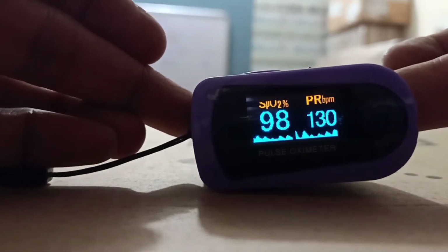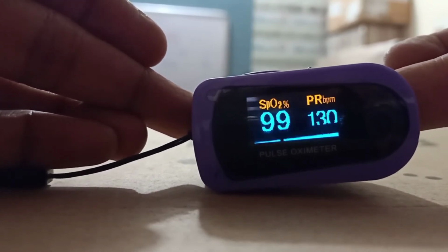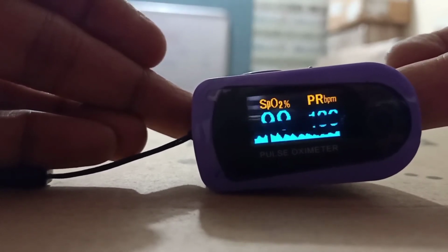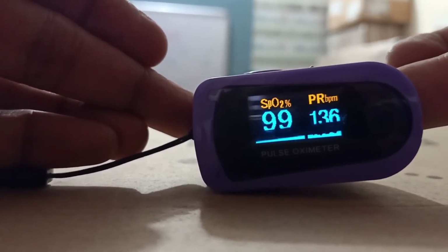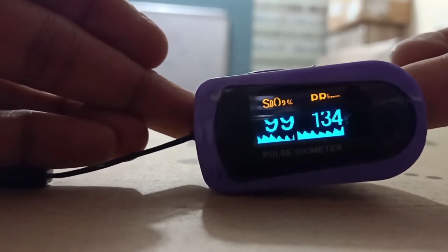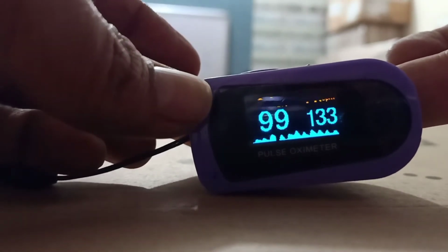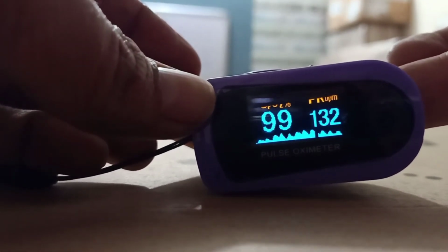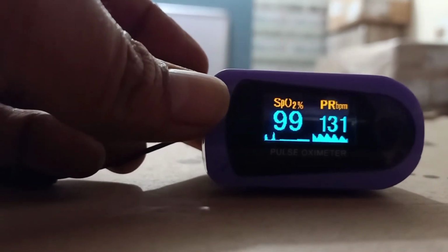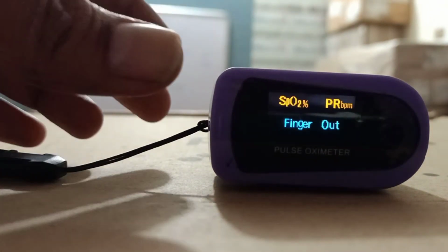There is a flicker because of the LED display, and you can see my heart is beating at 128 beats per minute. Probably I'm very excited telling you all this, but it is right. I've checked my pulse, it is running at around 130, and you can check my saturation level is fine, 99%. You got to be holding it at that period of time at least to know that a stable value is being reflected both in the pulse rate and the SpO2. And as you take your finger out, they automatically go off. So it tells you the finger is out, it can detect that and it will go off.